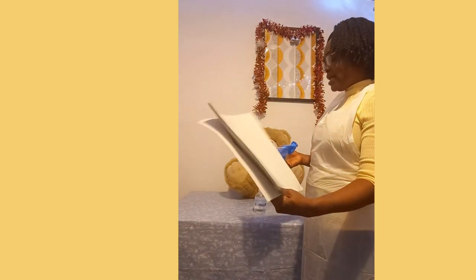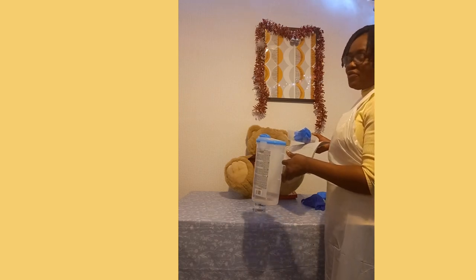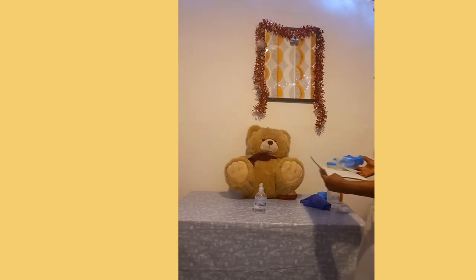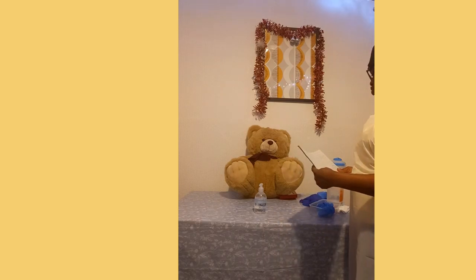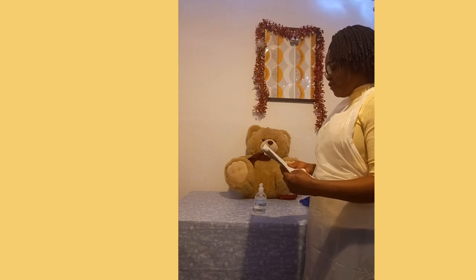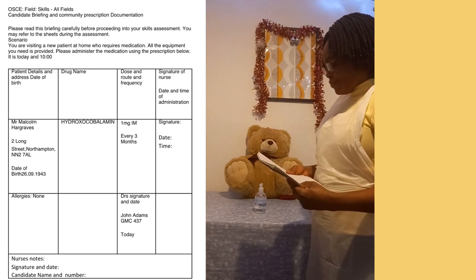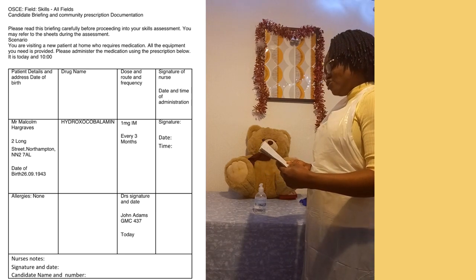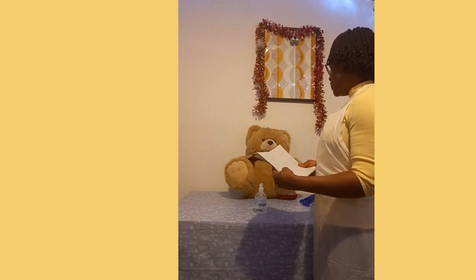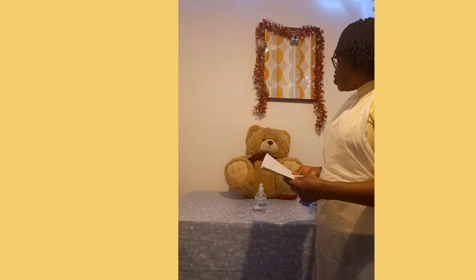I'm going back with my tray containing the medication and everything I'll need, my documents, and my improvised sharps box. Assuming I'm back at my patient's side — Hello Malcolm, I'm back. Are you still happy for me to give you the injection? Yes, nurse. Thank you. Malcolm, before I go on, can you please confirm to me again your full name and your date of birth? Malcolm Hargraves, date of birth 26/9/1943. Thank you very much. It is documented that you don't have allergies — correct? Yes, nurse. Are you in pain at the moment? I'm okay, nurse. I've now done NAP the second time.